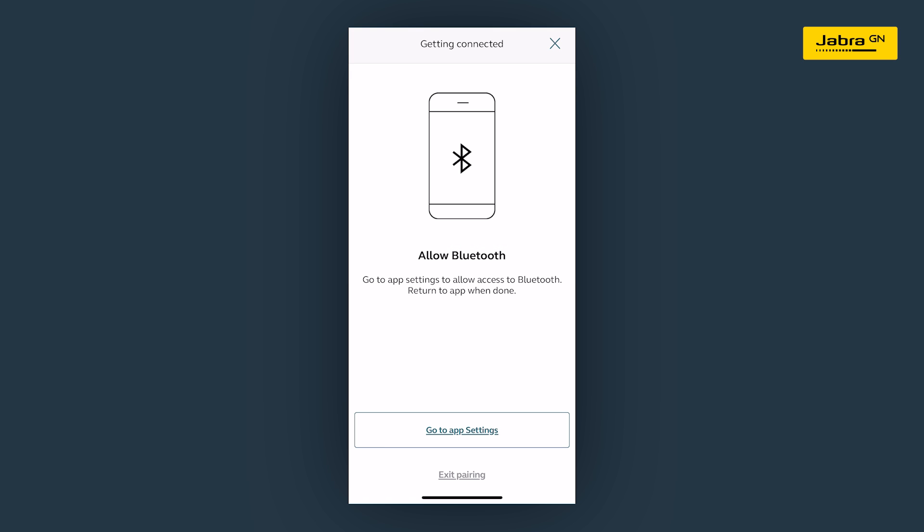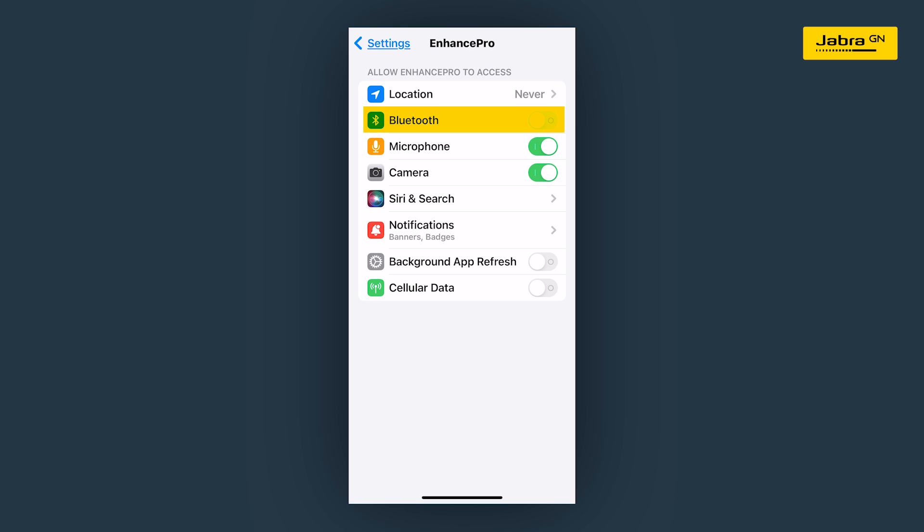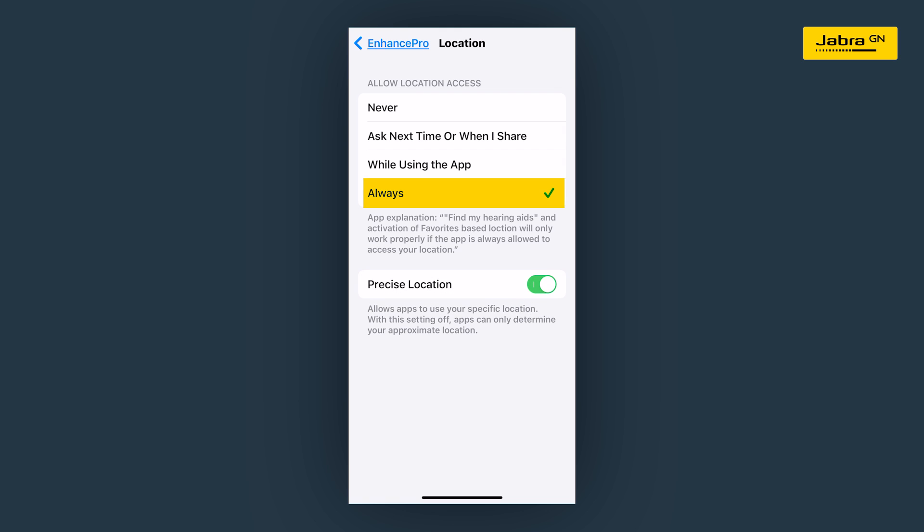The app will ask you to allow Bluetooth permissions — please allow. The app will also ask for location permission — please select allow all the time.